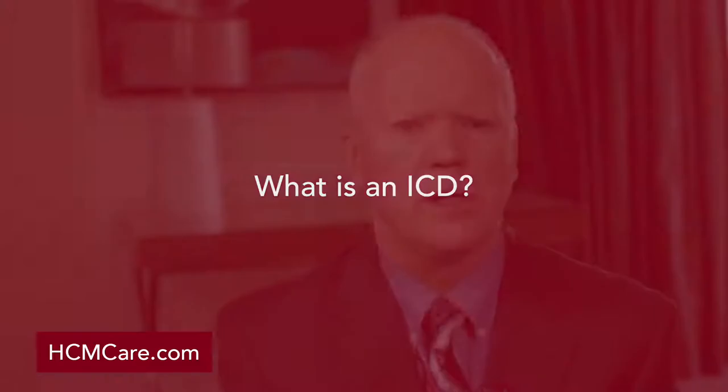What is an ICD? So an implantable defibrillator, really we should talk about an implantable defibrillator system, because it involves the generator and the lead or leads. So for the traditional defibrillator, the transvenous system, this includes the defibrillator unit or generator, or can, it's sometimes called, that's placed under the patient's collarbone in the front of the chest. And then that's connected to one or more leads, wires that go through a vein down into the heart. So there's one key wire that's in the right ventricle.